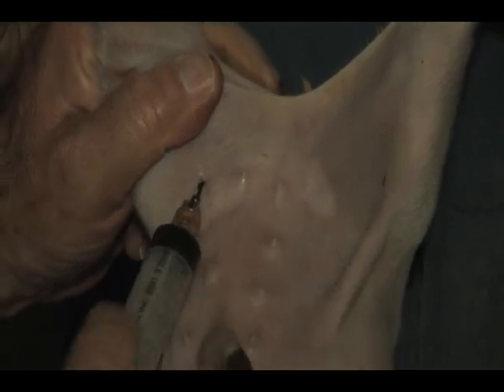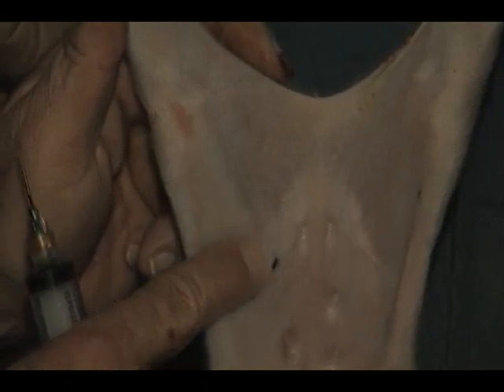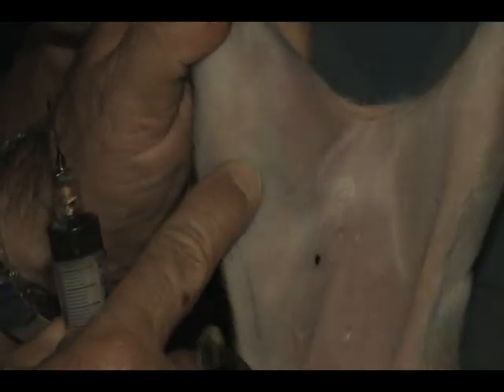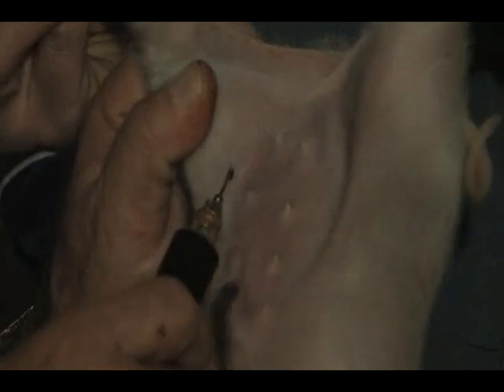Ahora vamos a aplicarlo en el jamón. La técnica es la misma: jalar la piel para que los orificios no coincidan. Aquí, afortunadamente, la piel es mucho más flexible. El orificio quedó en la parte abdominal, y se alcanza a ver el hierro a través de la piel, exactamente en el músculo. Nada de derrame. Se introduce la aguja, se aplica el hierro, y al soltar la piel, su orificio regresa al abdomen. Cero derrame, todo el hierro quedó dentro. Recordemos también que la práctica hace al maestro, por lo que habrá que repetir multitud de veces esta acción hasta dominar la habilidad.